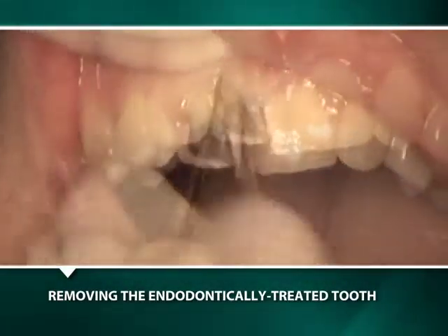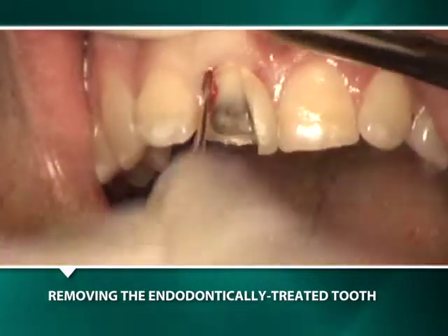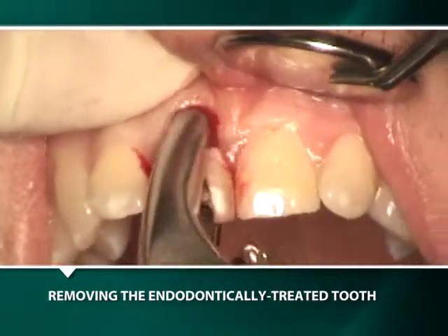The extraction begins with the judicious rocking movement of a periotome in the periodontal ligament space while apical pressure is being applied. The use of a periotome prior to using a forceps facilitates the preservation of the alveolar bone.